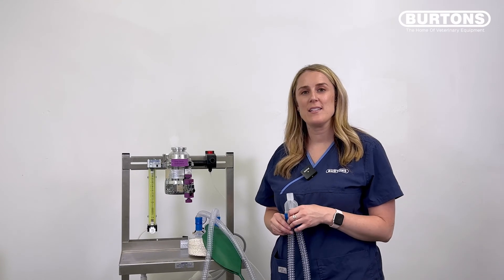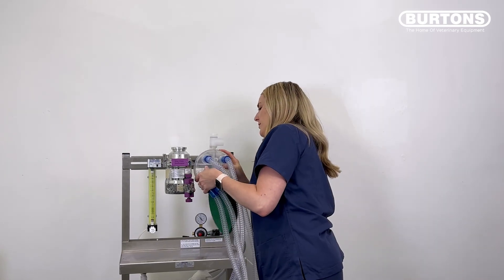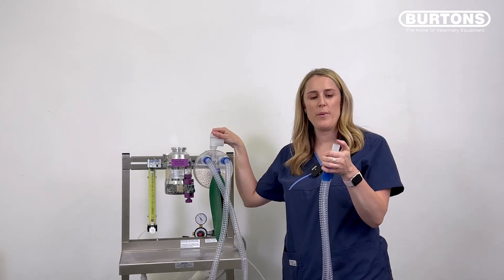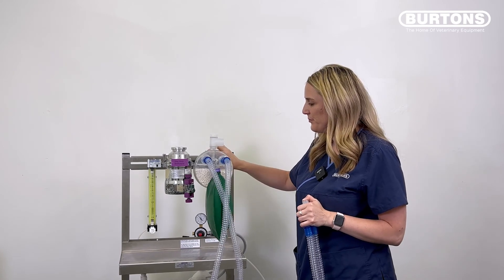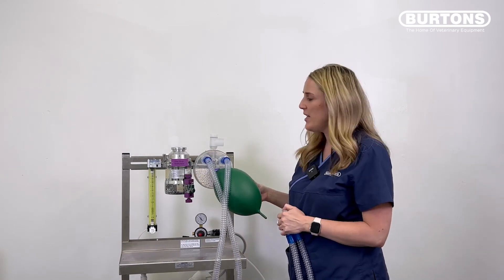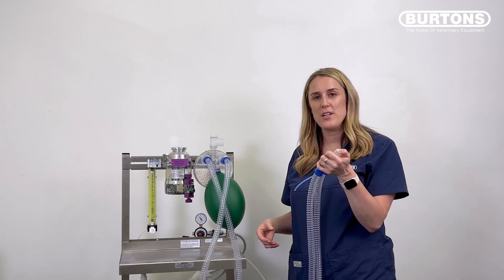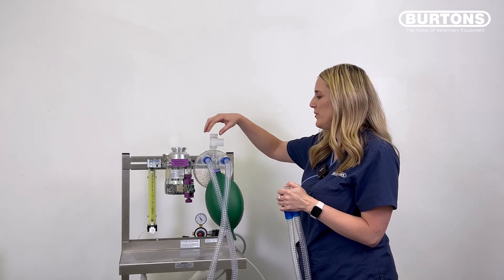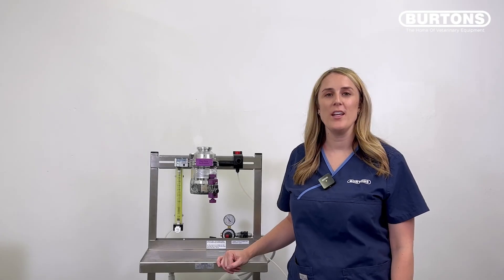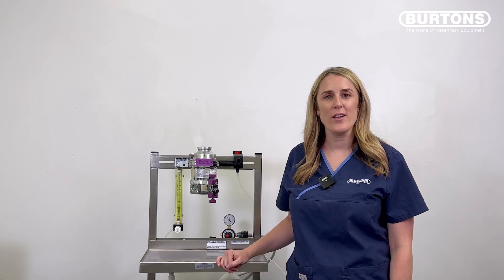In this video I'll show you how to leak test the semi-disposable circle system. Attach the circle system to the common gas outlet, close the scavenging valve, put your thumb over the patient end, and inflate the bag. You can see it is holding pressure and the valves are fluttering on the inspiratory and expiratory limb. Again, don't just lift your finger off the patient end of a circle system — open up the scavenging valve to relieve pressure before removing your thumb. Thanks everyone for watching. If you have any questions about the breathing systems I've just leak tested, please leave them in the comments below.